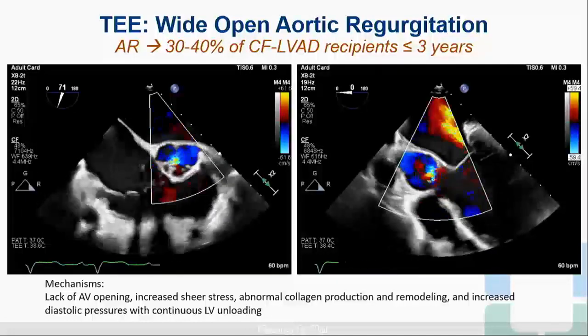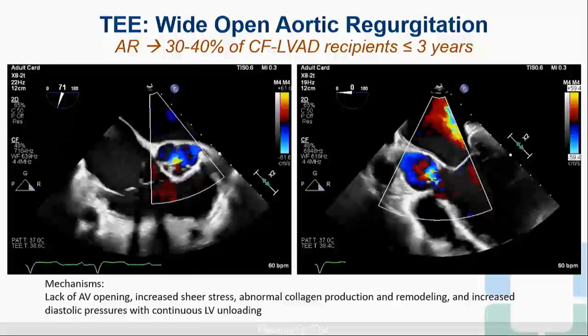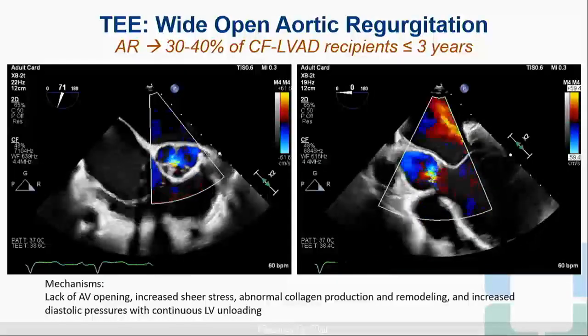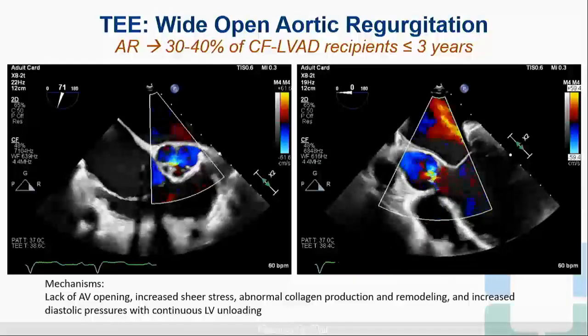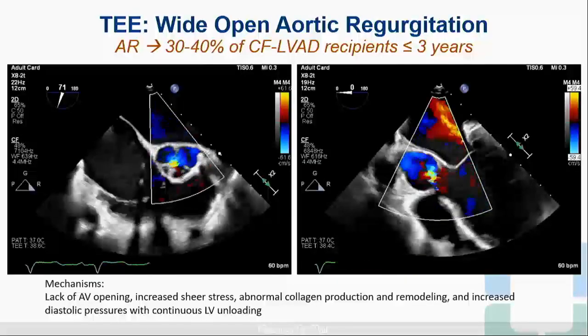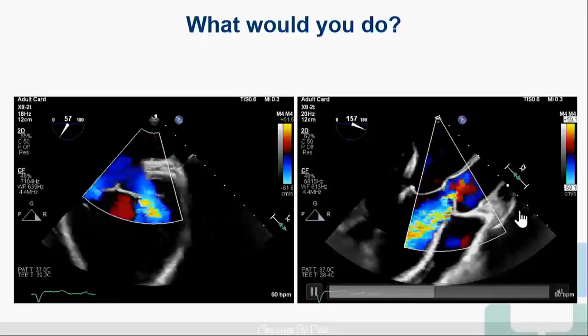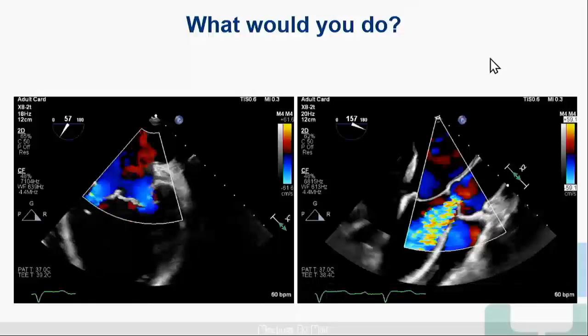And I know Dr. Kabadia did a retrospective analysis and meta-analysis comparing the difference between septal occluder device and TAVR back in 2017. And there was no difference in terms of AI severity. They're just the same percentage of people have device migration and more paravalvular leak in the TAVR group. So again, this is the same thing. We can see how bad the AI is.